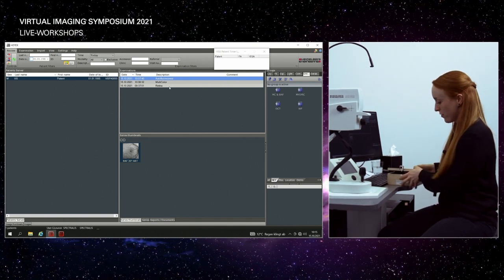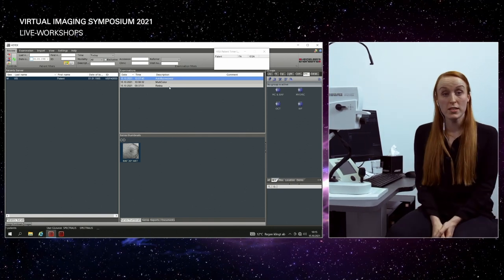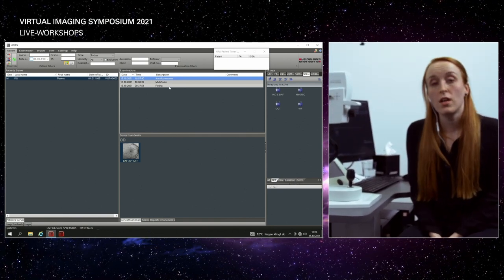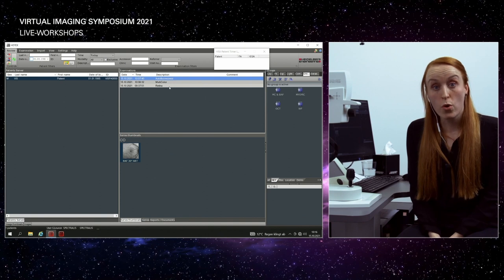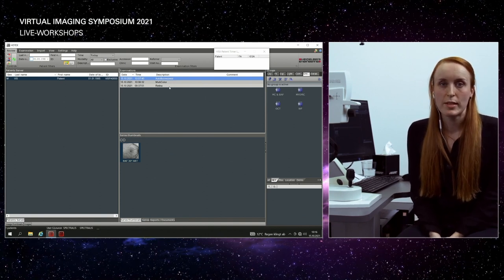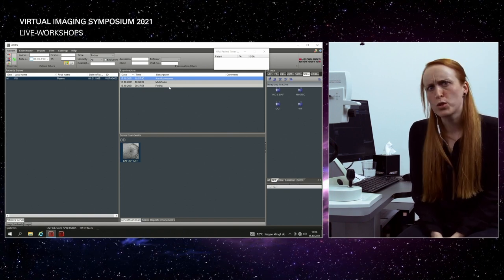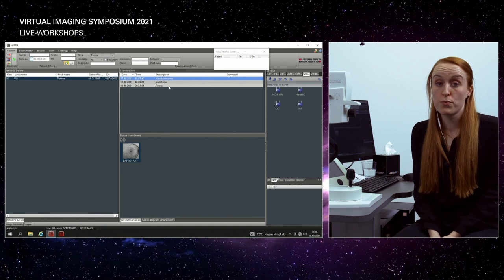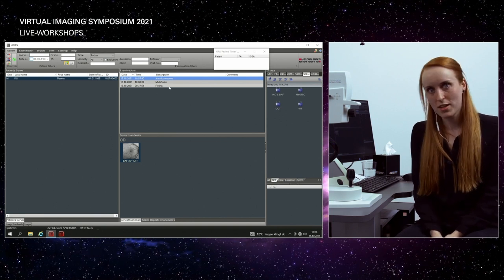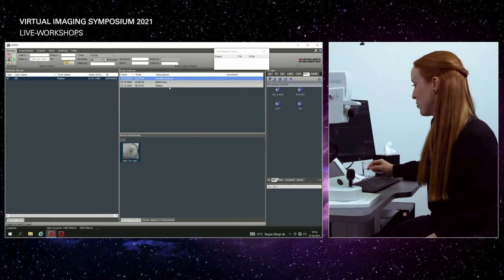When to use the wide field imaging? We can use it in combination with the multicolor imaging. We can use it if you combine it with the blue autofluorescence, but especially, of course, for angiographies, okay? As long as we are not doing an angiography right now, I will show you the multicolor, or first of all, the infrared image, and then the multicolor image, and maybe some new option for you to do.